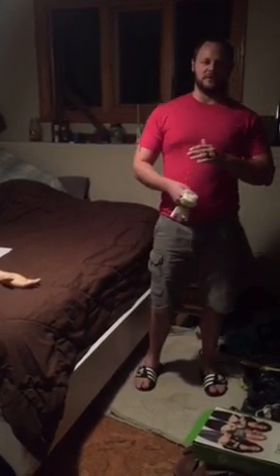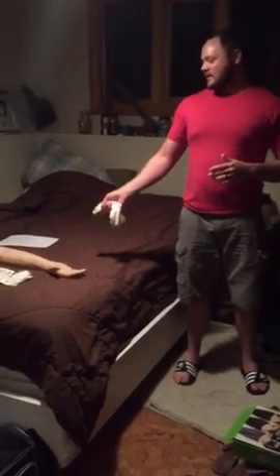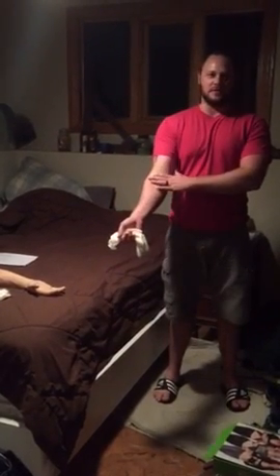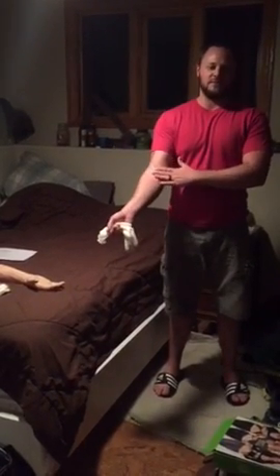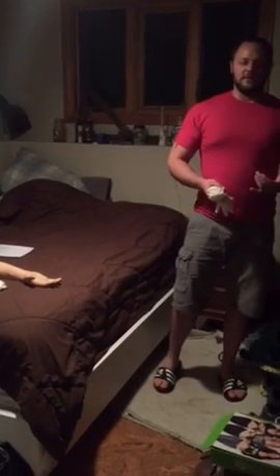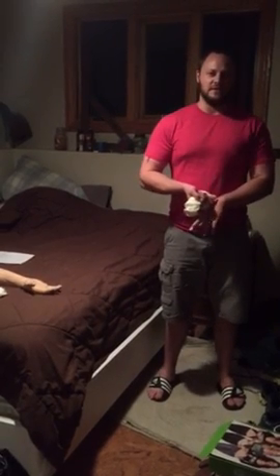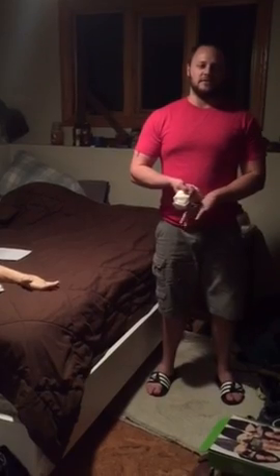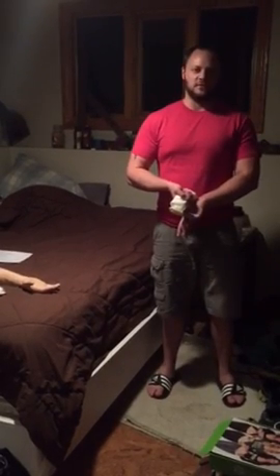This is a demonstrative speech for Dr. Fairchild's CMS 100 class. We're going to demonstrate how to properly initiate an IV into the antecubital fossa, or the AC area, the most commonly used area for an IV. During this speech, we're going to discuss who needs an IV, the supplies needed to start one. We'll go over the steps of how to initiate an IV, and then finally we will do the actual needle stick.